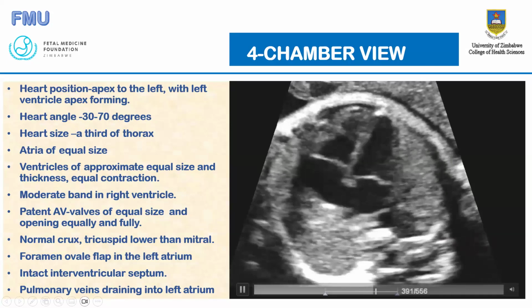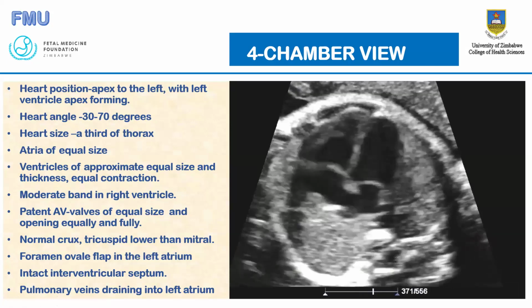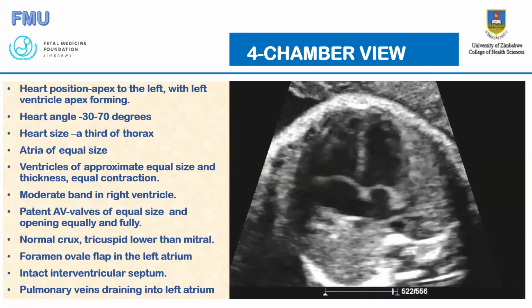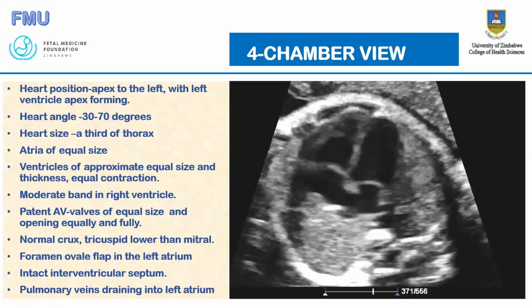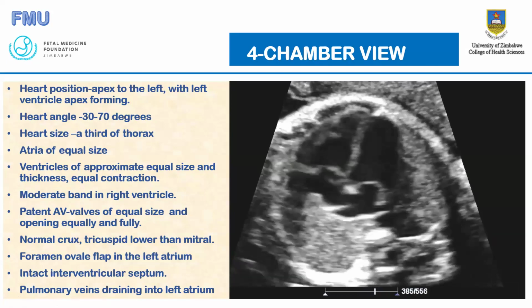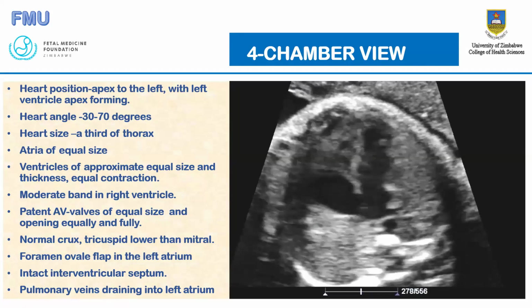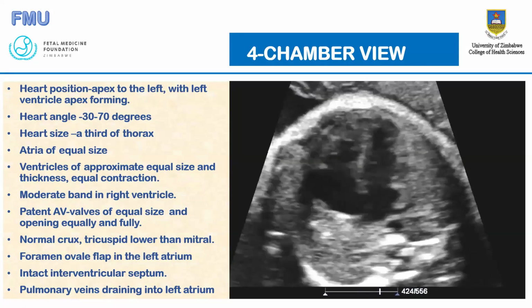If you check most of the machines we are using, there's something called cardiac setting or fetal heart setting. The reason why you have to use that cardiac setting, of cardiac examination, is so that you can accommodate the high frame rate, because those settings were already done to accommodate the fast beating of the heart.